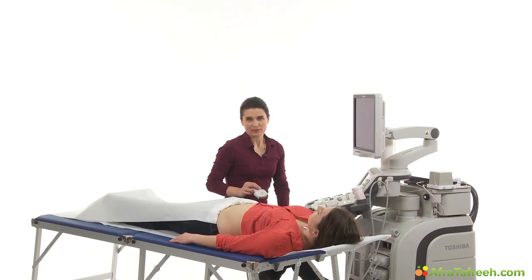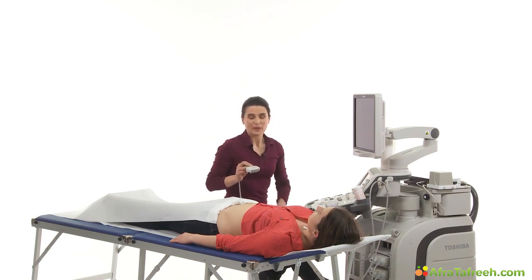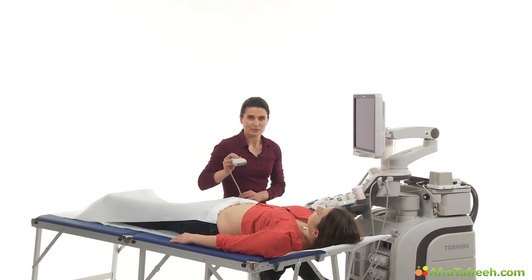The next thing I want to show to you is what an empty urinary bladder looks like. Why is this important? You should be able to recognize an empty urinary bladder in the lower abdomen. And when you're looking for residual urine, you have to be able to assess if the urinary bladder is empty or filled. So you will see this is not so easy at the beginning, but I will show you how to do it.